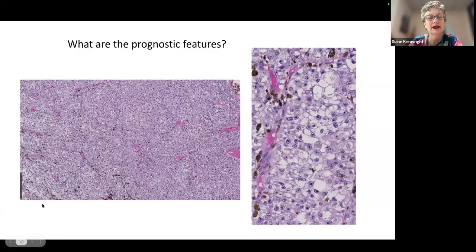Okay, so looking more closely here at this one, this is an H&E, and we can see that there are vascular loops. It is an epithelioid melanoma with quite light pigmentation. These are the pigmented macrophages that often line up against these vascular channels and are easy to mistake at low power for tumor cells. We sometimes call them melanophages. And the nuclei, well, they're kind of small if you can see them, but they're definitely not these epithelioid ones.